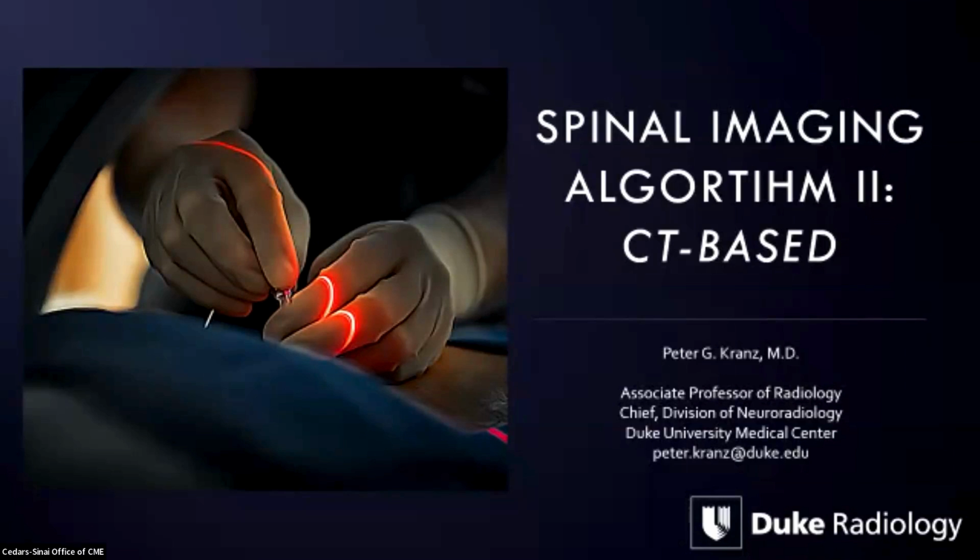What I'm going to present today is the way that we work up spinal imaging using a CT-based approach. And for all the jabs that we like to throw at each other, I think it really is true that whether you use fluoro-based techniques or CT-based techniques, they're tools. And you can be very good with the tools that you have. It's probably impossible to answer which modality is better. It's more important to be very good with the tools that you use.